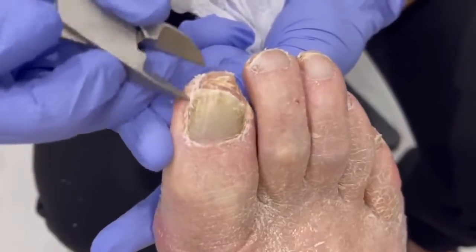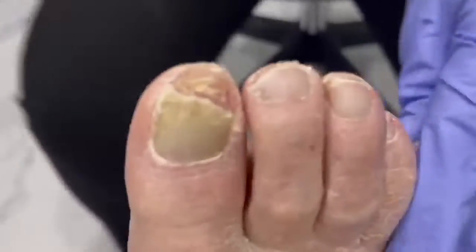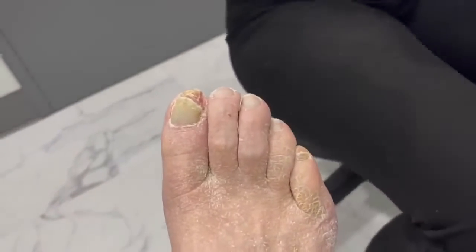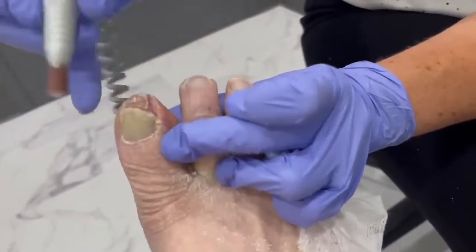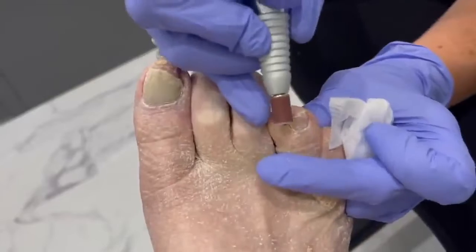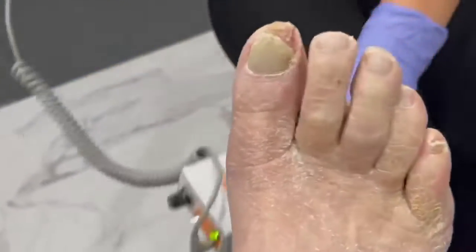Perfect — look at all that. Let me grab the Dremel real quick and smooth them out. We might even paint them pink if he's real nice to us — as long as we let him keep the toe. With this, because his nails aren't so thick, we really just want to smooth them off and make sure there's nothing that will snag on his sock.